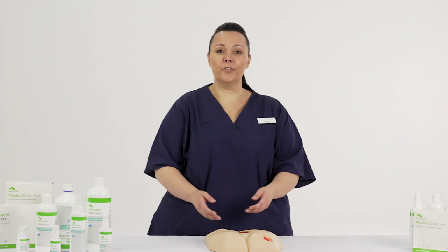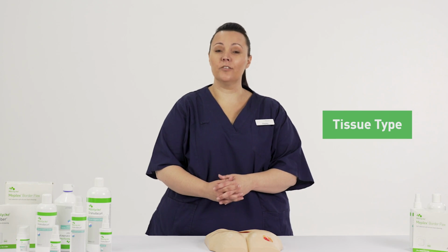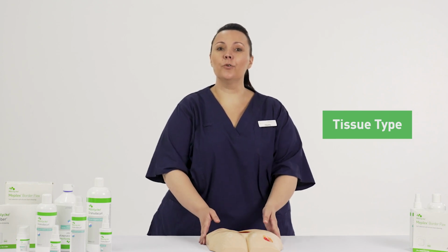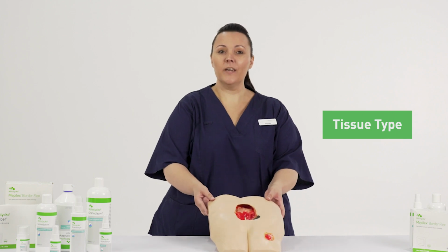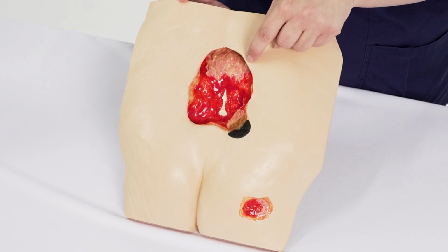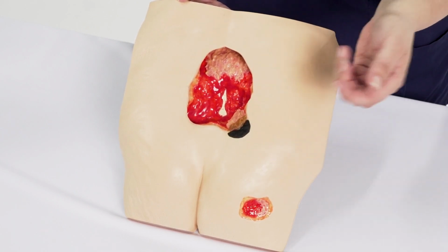When assessing the wound, it is important to assess the tissue type in the wound so that we can ensure that we are using the correct solutions. In this example, I'm using a simulated wound model. In this wound bed, we can see that we have some red, healthy granulation tissue, some gelatinous slough, and some more tenacious slough, as well as some necrotic tissue.